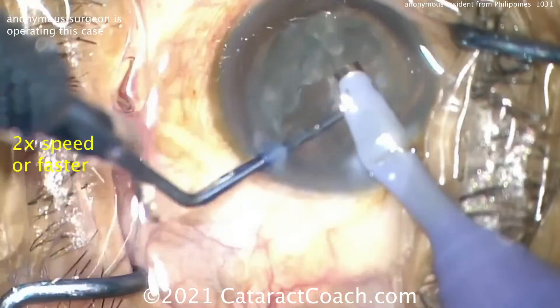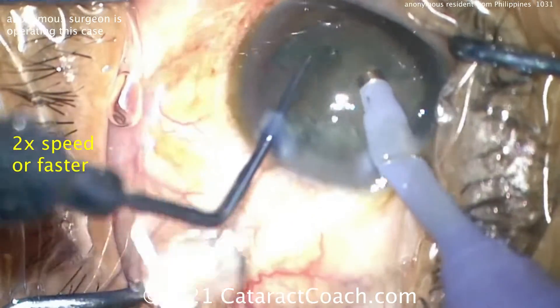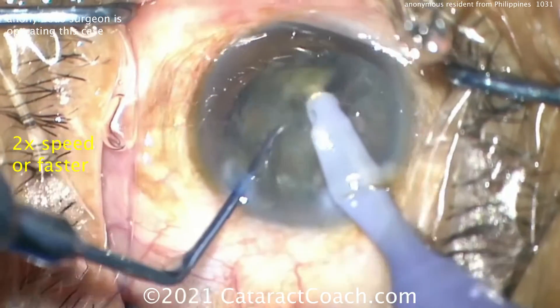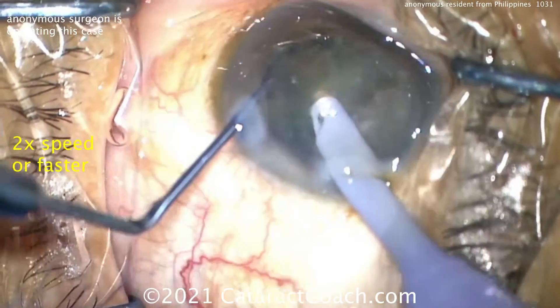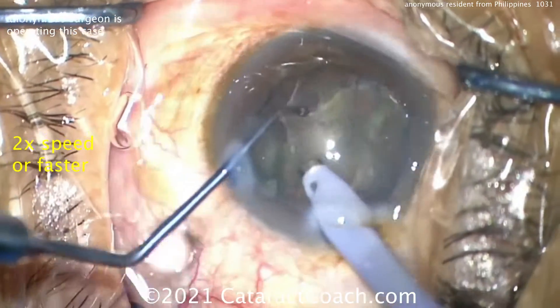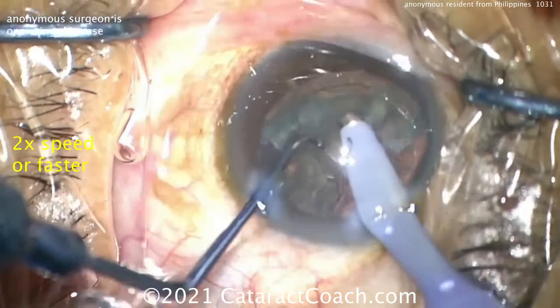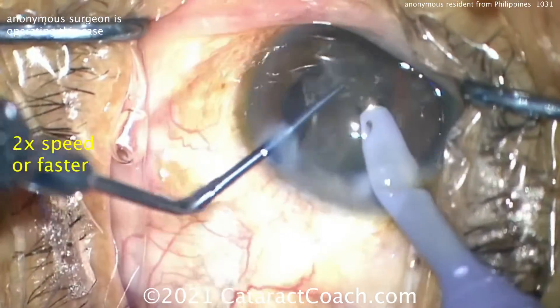The piece is coming down — very nice technique, going fine. Spinning the nucleus around, here's the second half; the chopper is placed with a little holding power. Now this surgeon needs to spend more time keeping the eye in primary position. See how the eye keeps drifting away — look at the three Purkinje dots; they're not in the center of the cornea because the eye is not in primary. Put the right hand down, make the phaco probe more flat, almost parallel to the floor, and that will get the eye back to primary. A mark of an advanced surgeon is that the eye stays in primary the whole case.